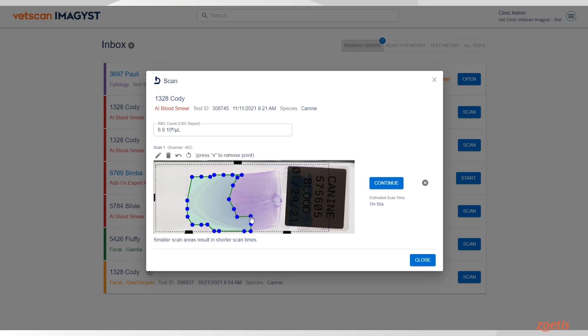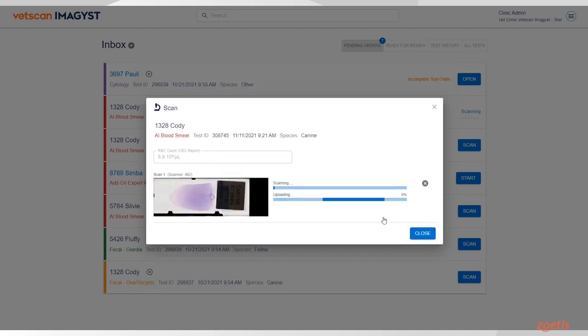If the scan area and estimated scan time are acceptable, click Continue and the scanner will take it from there.